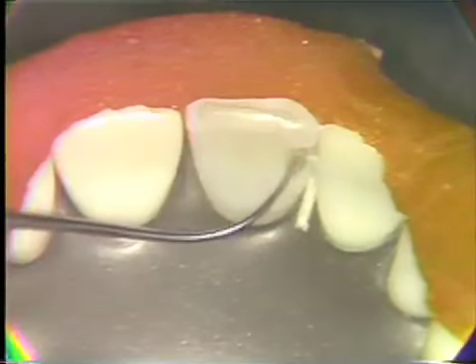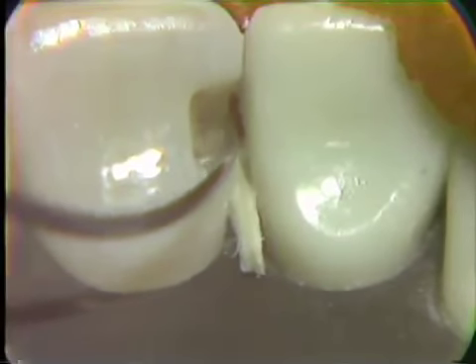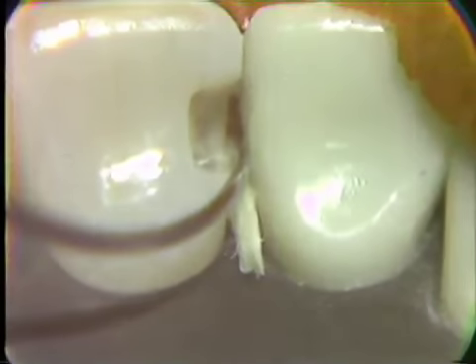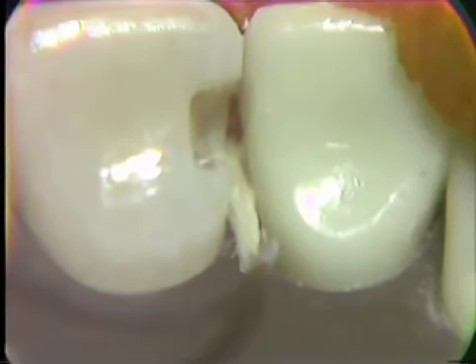As we look into the preparation, we can see that the red acrylic here has formed a continuation of the labial wall of the preparation. Again, it gives us a wall against which condensation can occur. We've gained some slight separation with the wooden wedge having been put in place previously.